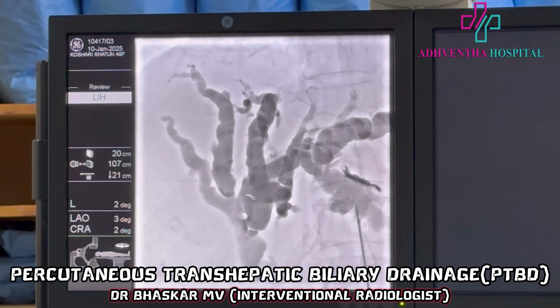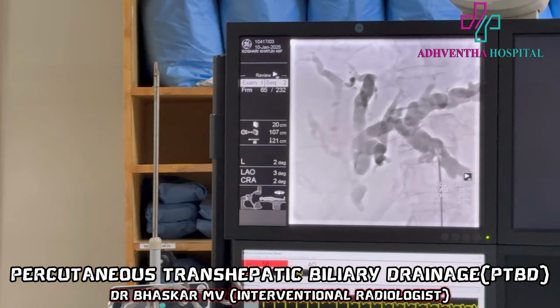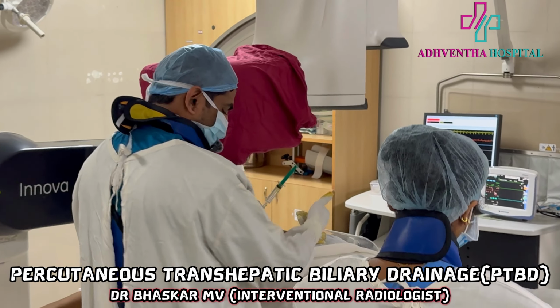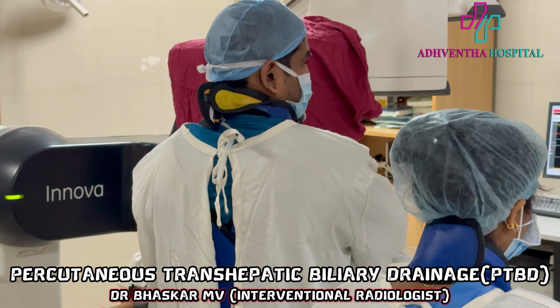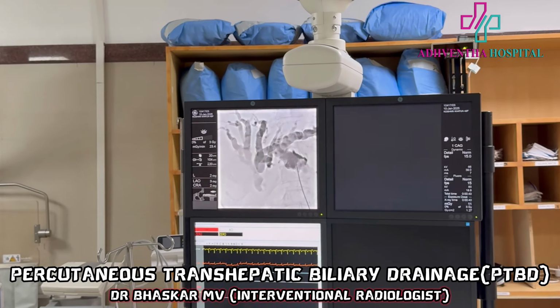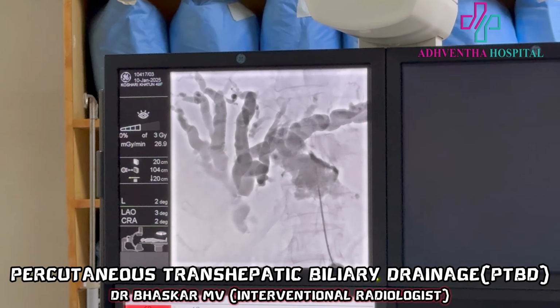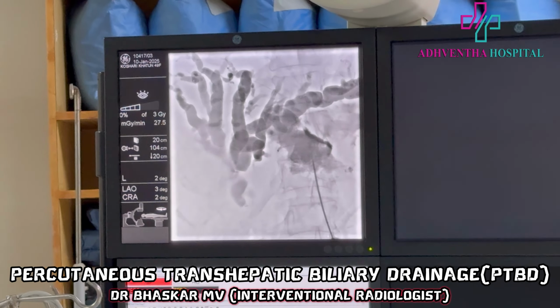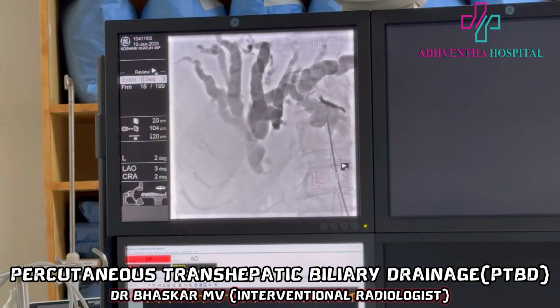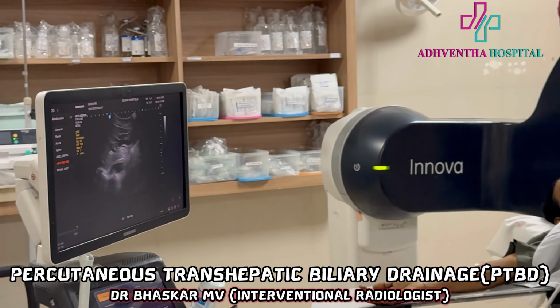I'll still distend a little bit so that even after decompression some amount of contrast will be there, easy to see the things. Okay. So gross dilated. So let us see the needle position now.